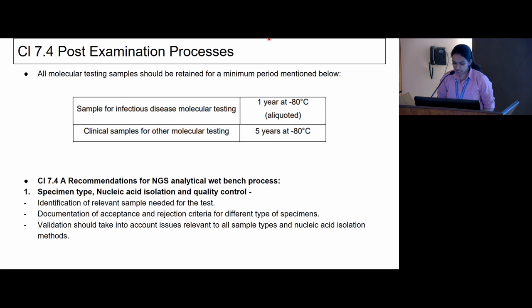In case of post-examination processes, the samples for infectious disease in molecular testing should be stored for 1 year at minus 80 degrees Celsius. Clinical samples for other molecular testing can be stored for 5 years at minus 80 degrees Celsius.